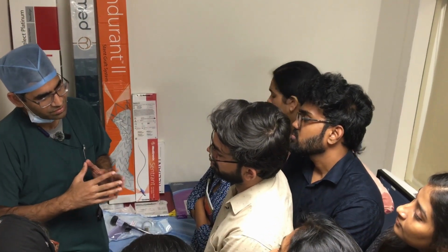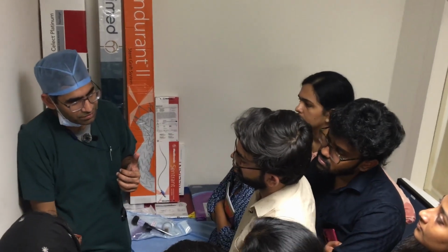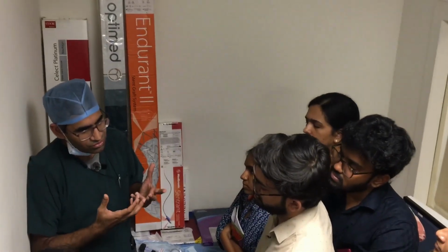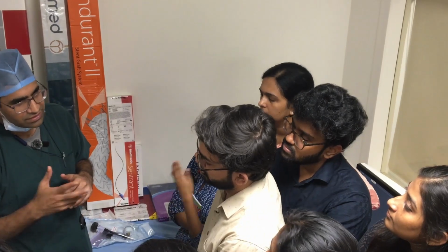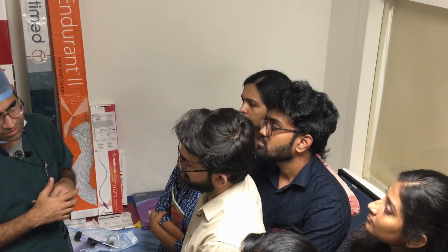If you have any exposed artery which is amenable to compression, carotid, femoral, pedal, anything, you should not use a balloon expandable stent because they don't have radial force of their own, especially in moving joints, knee joint, all these things. Balloon expandable should not be used. So you have to use self-expandable stents.